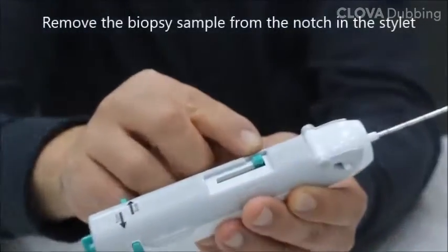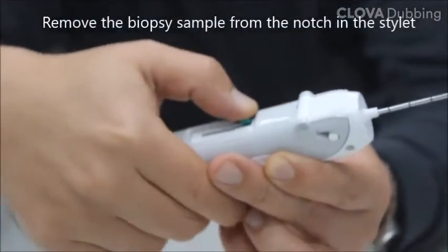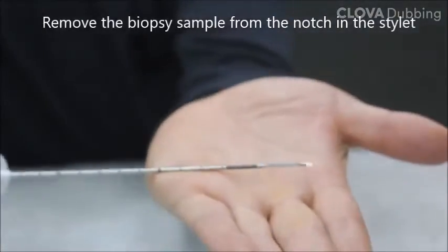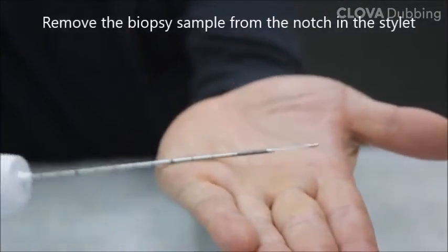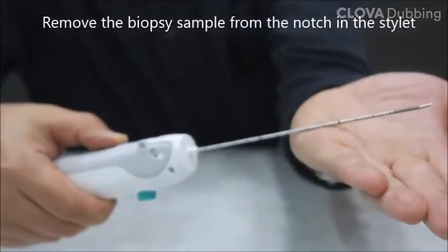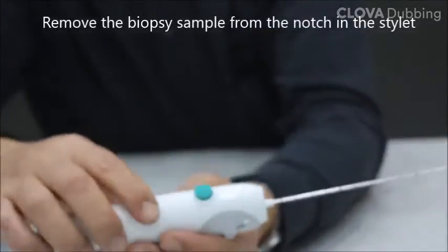Expose the notch by moving the cannula using the tissue collection button at the bottom. Remove the biopsy specimen from the notch of the stylet. This needle must be used by a physician who has learned intervention techniques and is familiar with possible side effects.